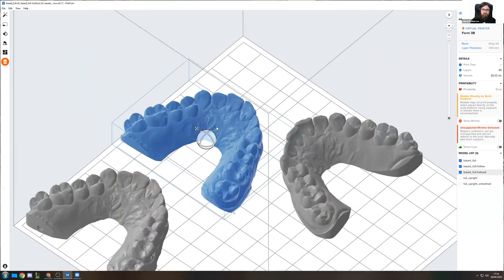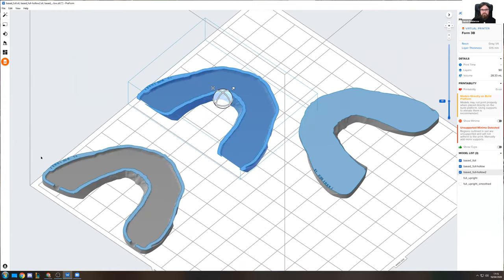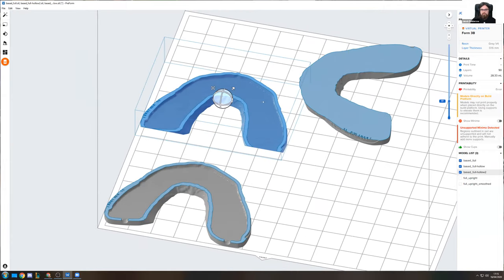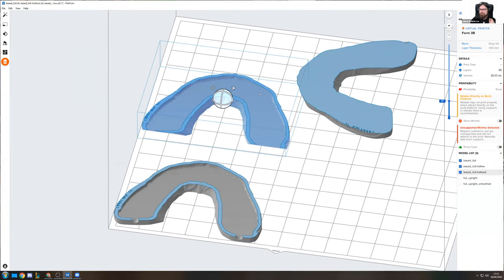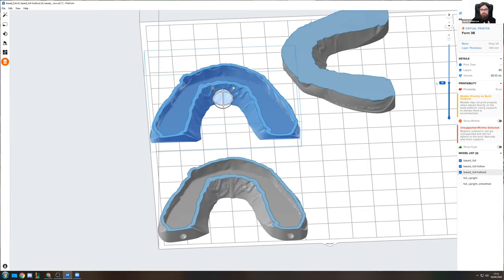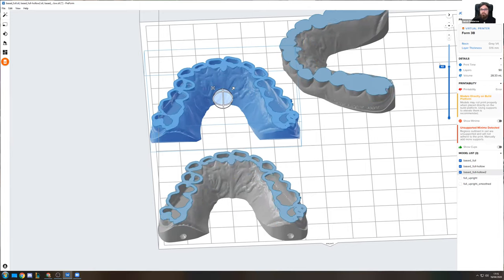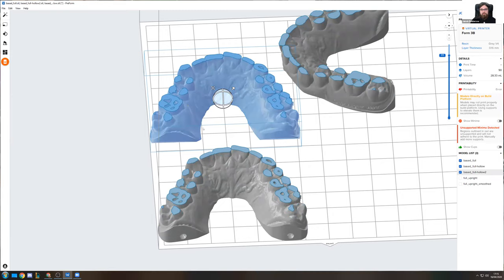So these two models are hollow. You can't see it right now, but if we use the slicing tool on the right side again, we can actually see that I have them with just a super thin wall inside. If I remember correctly, I did around 1.5 millimeters of wall thickness, which is totally fine for these kinds of models, and have them be completely hollow. This can help you save quite a lot on the cost of resin. We can just go through here and see how hollow these models are.